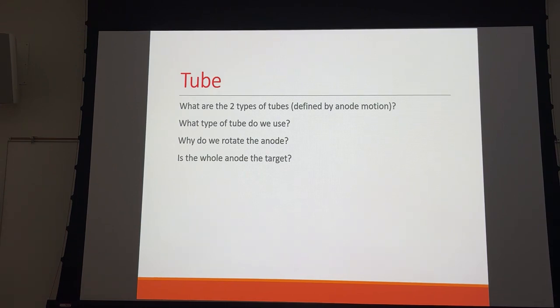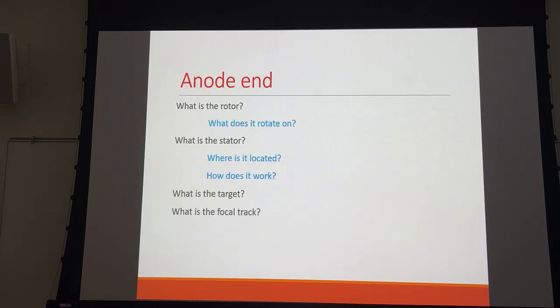Then we got the disc, and then we got the stem, and the stem is where we get the rotation, right? And then even on the outside of the X-ray tube, we consider it a portion of the X-ray tube, and it's certainly a portion of the anode assembly, and that is your electromagnets, and they are responsible for rotation of the anode, right?